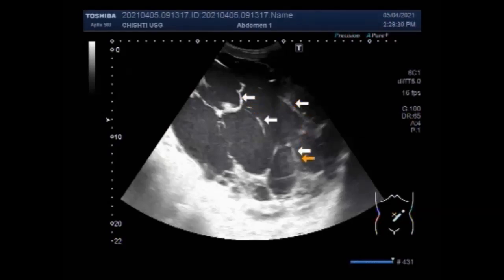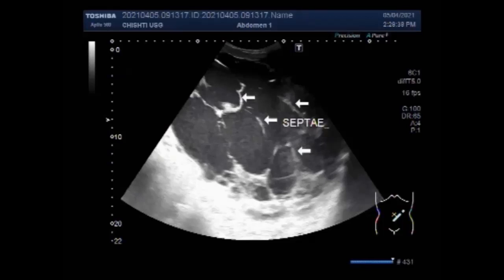These are the septa which are dividing the extraperitoneal collection into different portions.